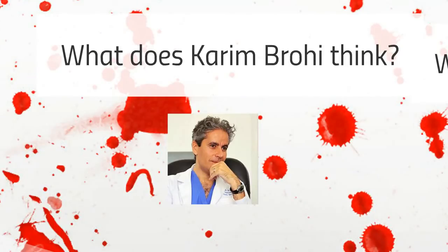And we have it in our emergency department as part of a research program. We are essentially trying to come up with an evidence-based algorithm using an observational study before we actually use it to guide our clinical resuscitation. I think it's always going to be some sort of hybrid between an empiric treatment first off and then moving to a TEG guided thing. And how we actually do that is hopefully something that we'll have some beginning answers to within the next 12 months or so.